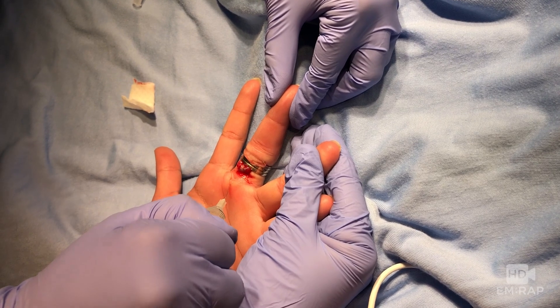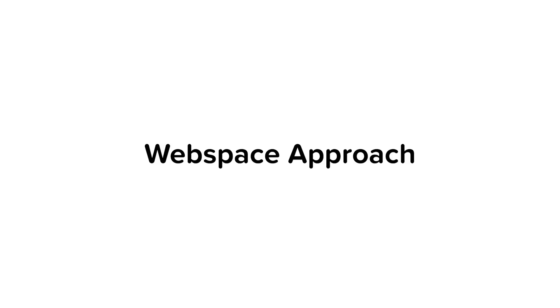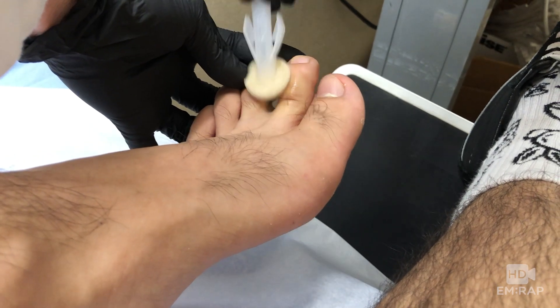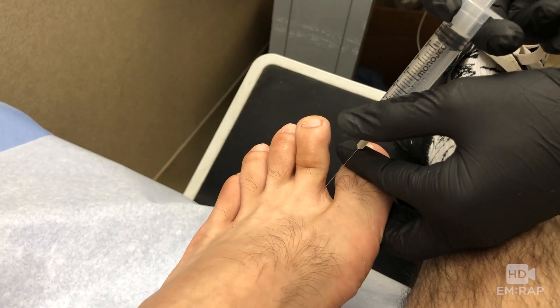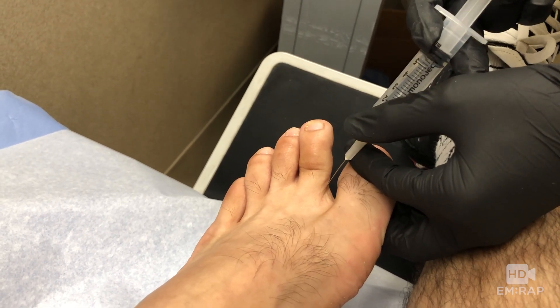After the injection, the patient can hang their arm down, letting that anesthetic spread with gravity. The web space approach to a digital nerve block is quite simple, shown here on a toe instead of a finger. Once the skin is prepped, introduce the needle into the web space with the needle tip aiming right down the middle.